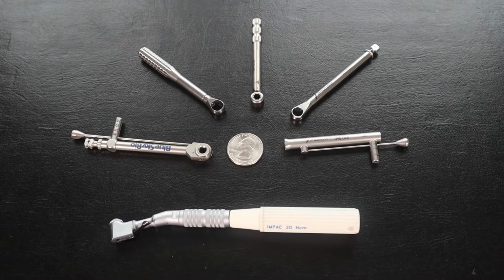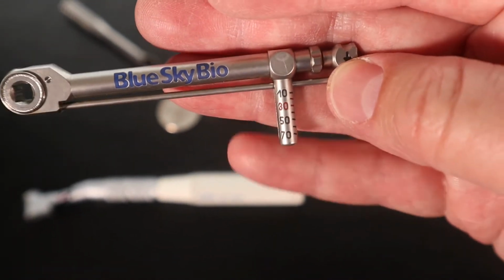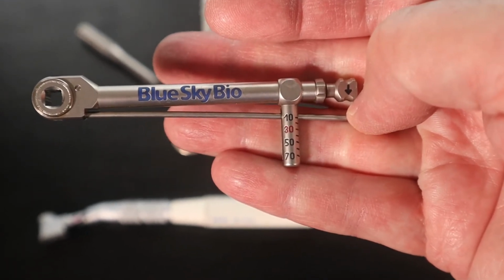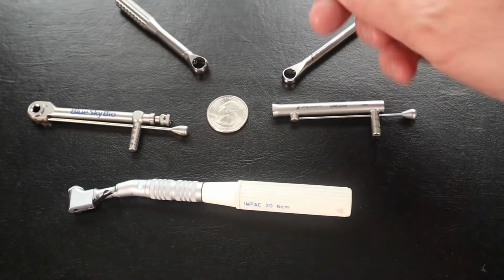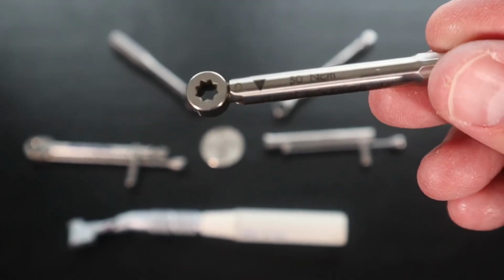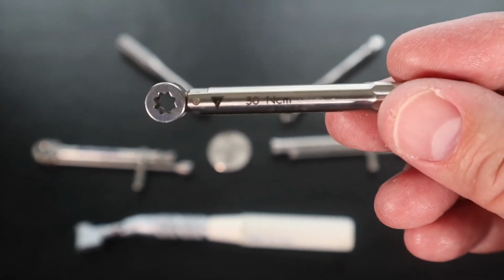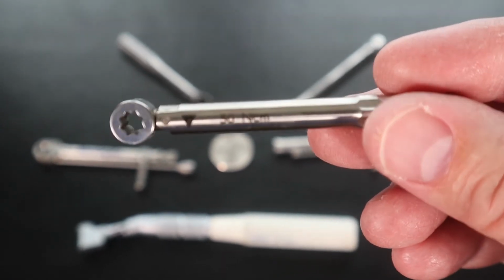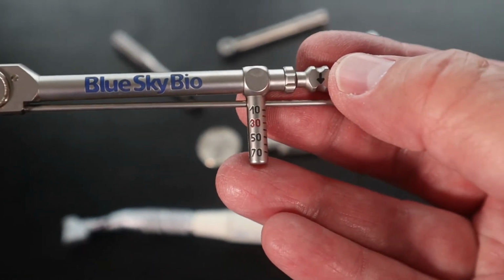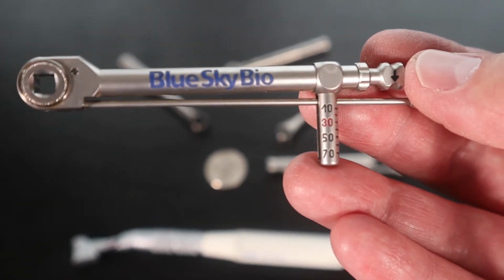So this is my collection of torque wrenches that I use. They come in two different styles. So this is the beam style of torque wrench. As you twist it, this lever gets deflected and you can see how much torque you're putting on the screw as you're tightening it. The other style are a click type. As you're tightening this one, it'll make a click, and the handle will give a little bit, and that tells you that you're at the proper torque value. This style comes calibrated for a specific torque value. So this one is 30 Newton centimeters. The beam style, because you have a direct readout, you can change how much torque you're putting on it. So this one you can torque something to 10 Newton centimeters all the way up to 70 Newton centimeters.